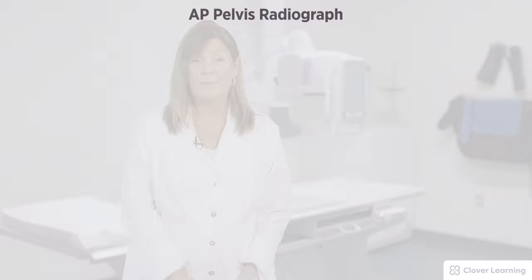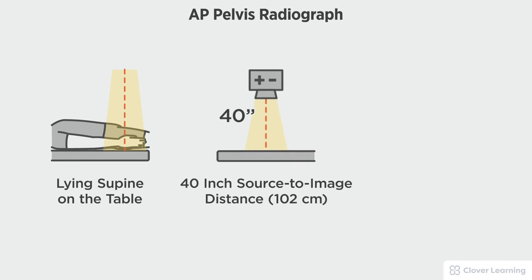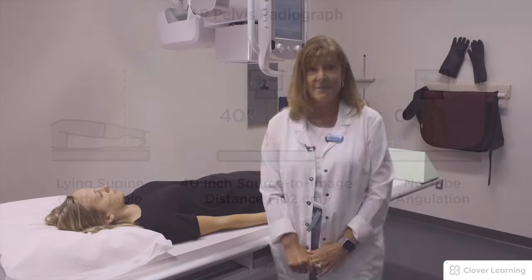In this video we will be demonstrating the AP pelvis. The AP pelvis should be performed with the patient lying supine on the table with a 40-inch source to image distance and no tube angulation.